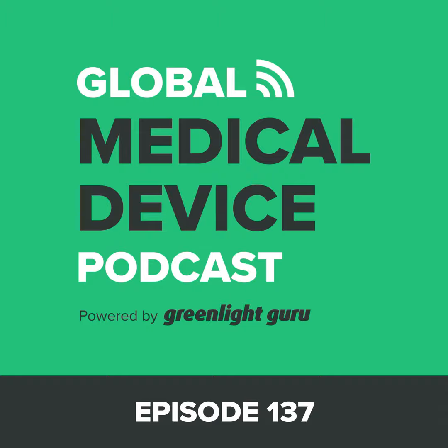I think prior to MDR, it was possible for some software to be considered class 1. I believe all medical devices that contain software or software as a medical device are at least class 2 and maybe higher with the new EU MDR. Is that your understanding as well?